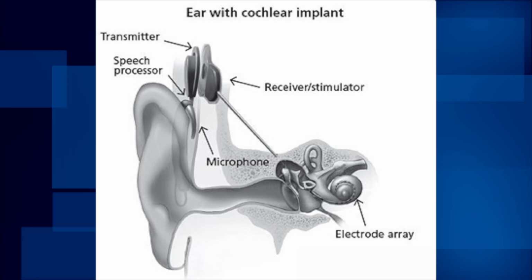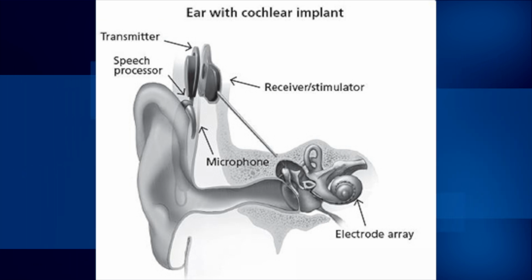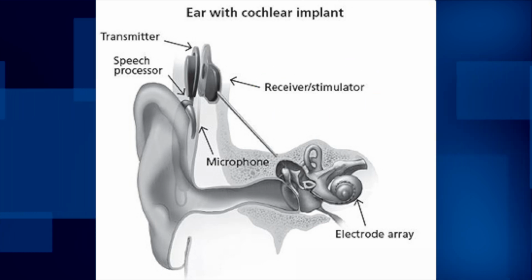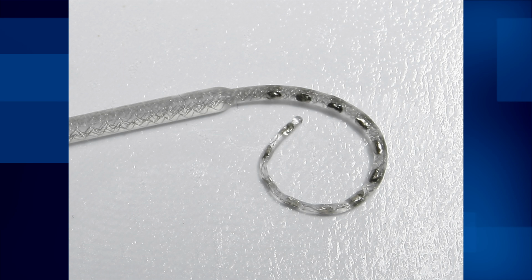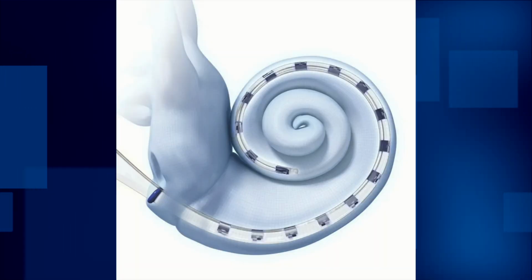Now let's take a look at what a cochlear implant actually is. A cochlear implant is comprised of two general components: the external component and the internal component, which both work together. The external component has a speech processor with microphones that pick up sound and converts it into an electrical signal, and a transmitter with a magnet that sends that electrical signal to the internal component that is implanted under the scalp. The internal component also has two parts: the receiver stimulator that also has a magnet that receives the electrical signal from the external transmitter, and the electrode array, which typically houses anywhere between 12 and 24 individual electrodes that stimulate different regions of the auditory nerve, which is implanted into the cochlea, otherwise known as your hearing organ.